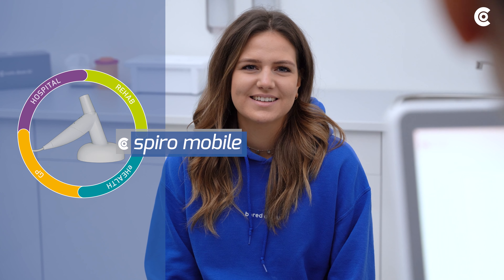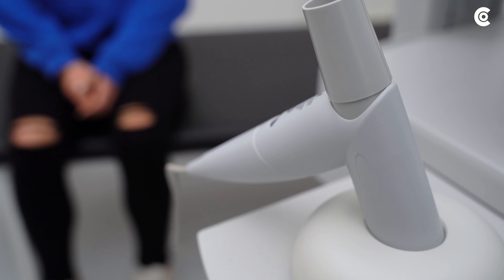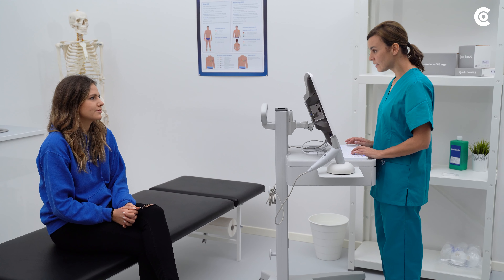This video shows how to carry out the pulmonary function test on the Customed Spiro mobile device in order to ensure good results.